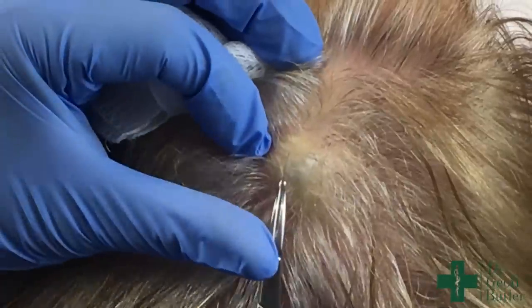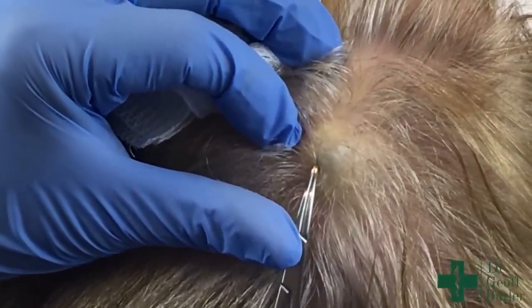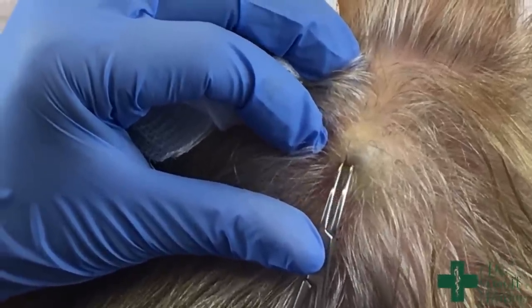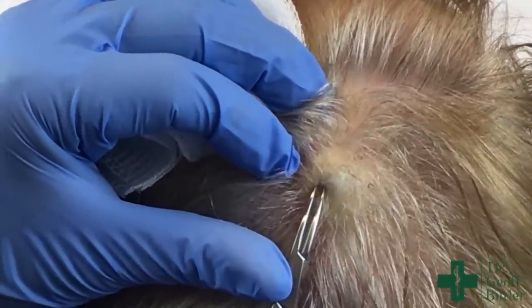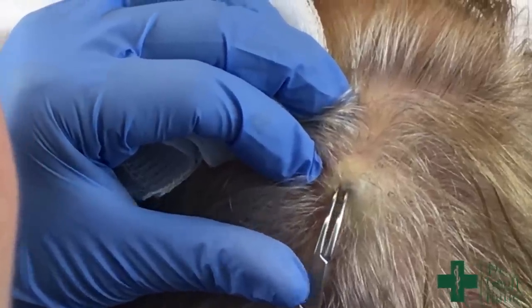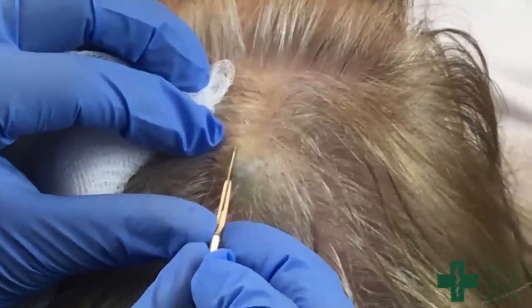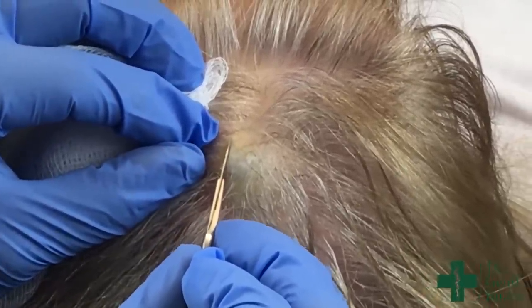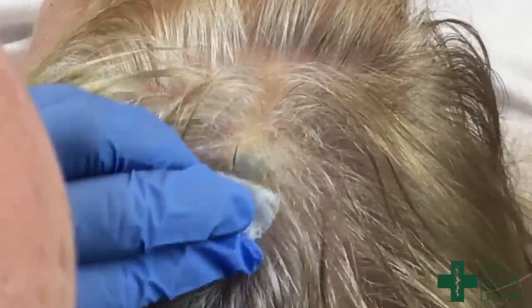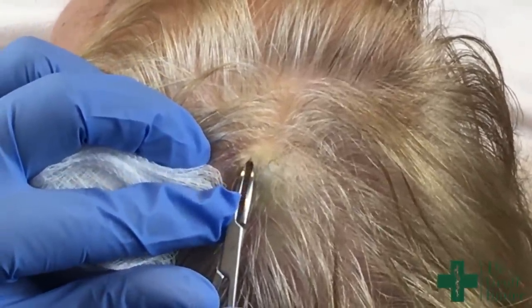These are curved cryleys. I use them just to see if I can open that up a little bit. Don't be frustrated with it — you won't tear the tissue or anything like that. Because it lies superficial, I want to do it very slowly. You can tell here it's not opening, so I just need to add a little bit more pressure. I'll pick the number 11 blade up again and add just a little bit very slowly. Sometimes if it's under a lot of pressure, you can elect to pick an area just off to the side just so you can maintain the capsule.